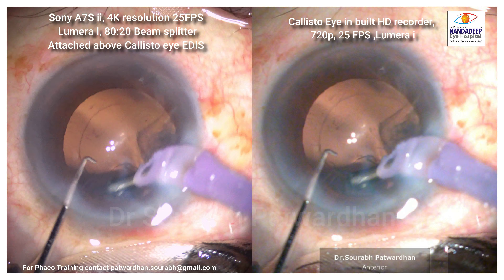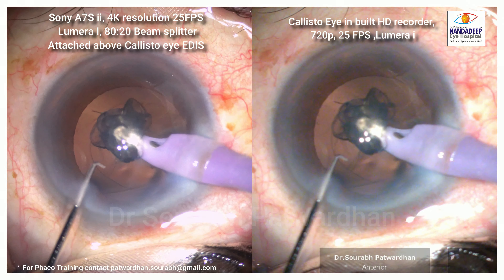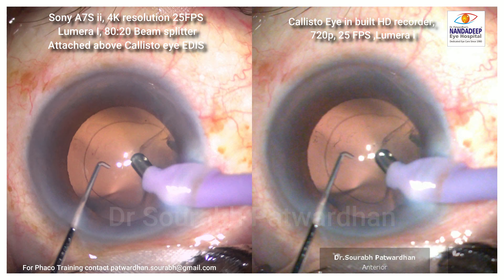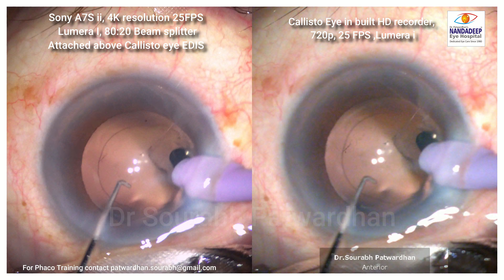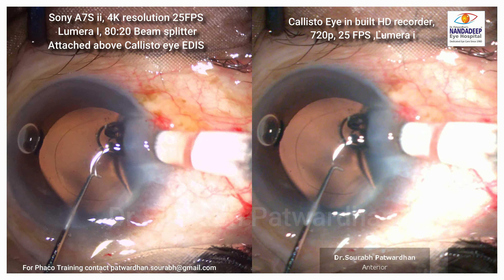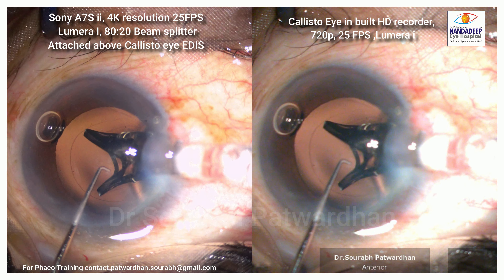The advantage of recording in 4K is that even if you crop the image — for example, if you want to show a particular small part of the video — it will be seen more clearly. If you look at the contrast, I tried to match both videos, but there are some areas which are washed out.